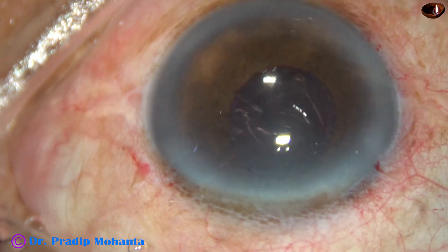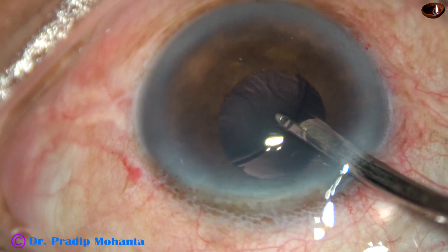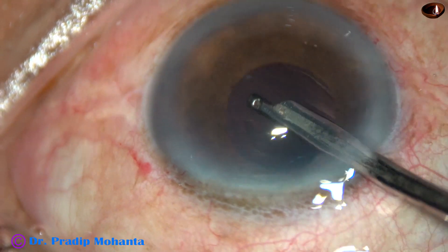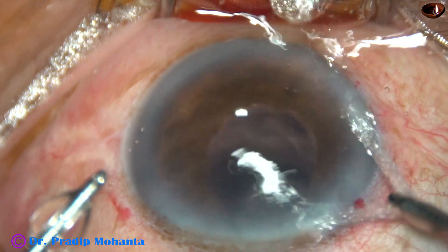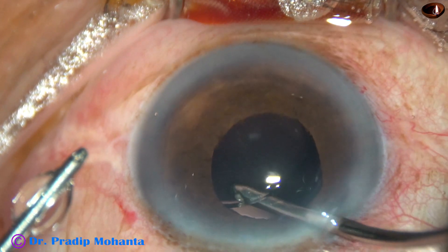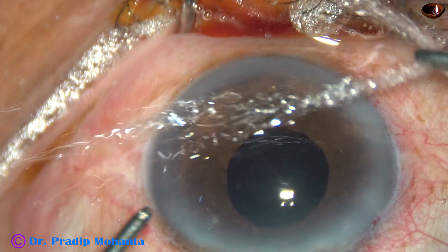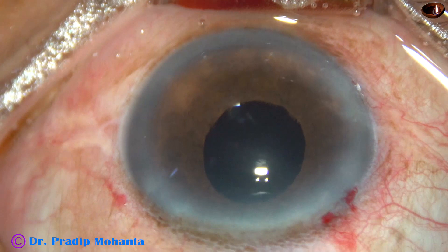Many surgeons neglect this step and remove only half or two-thirds of the viscoelastic. But if we spend adequate time, we can clean it very nicely. We must remove the viscoelastic from the anterior chamber, the posterior chamber, and from the capsular bag — these three areas must be free of viscoelastic. I use both Simcoe as well as bimanual irrigation-aspiration for this cleanup. Viscoelastic is cleaned from the capsular bag, then from the posterior chamber, then from the anterior chamber. In this way, thorough cleaning is done.